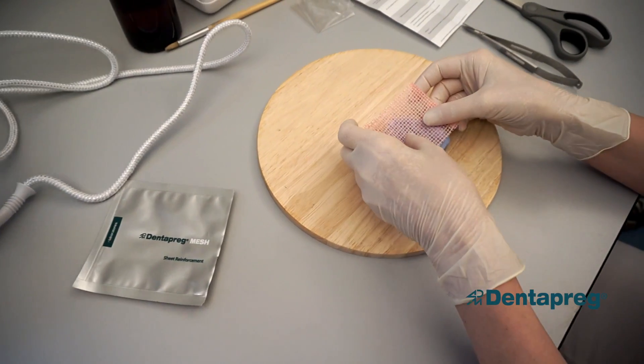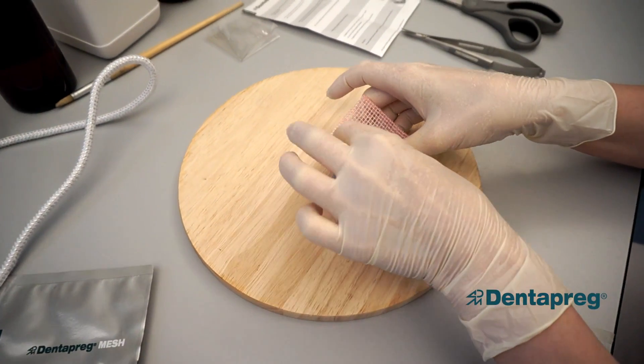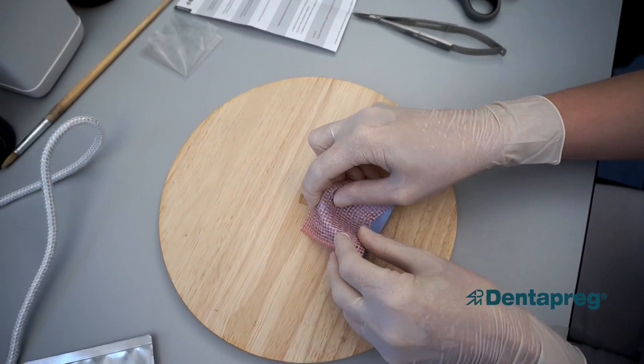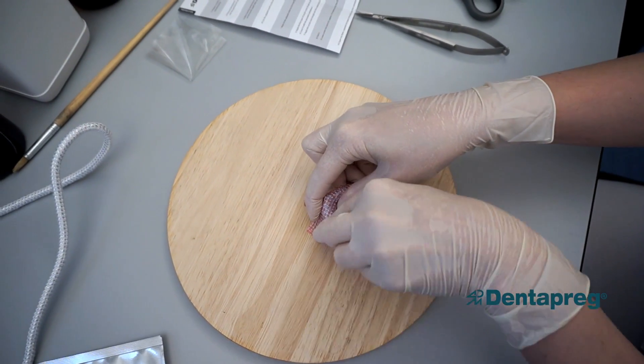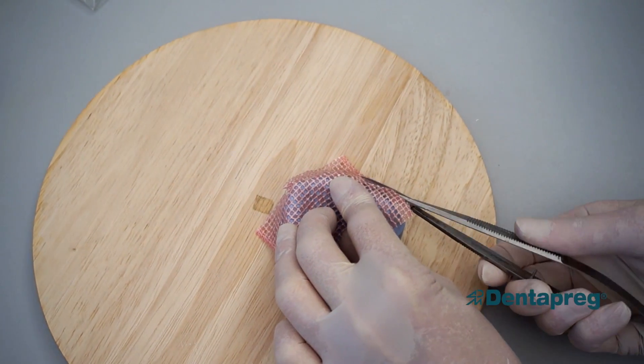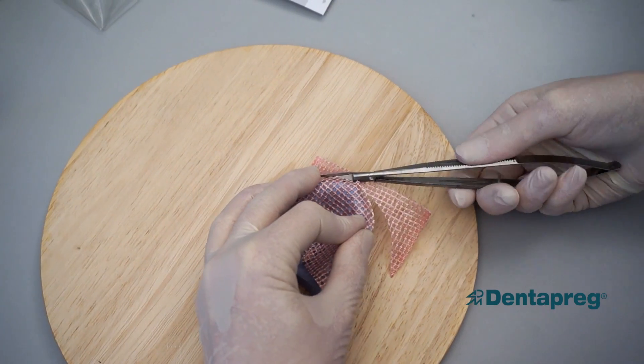Remove the paper and adapt the mesh on the stone model. Wait until it cools down and maintains the desired shape. Cut the mesh to the required shape with regular scissors.